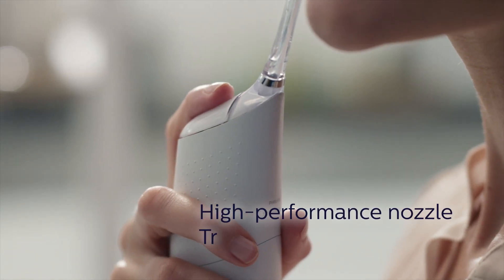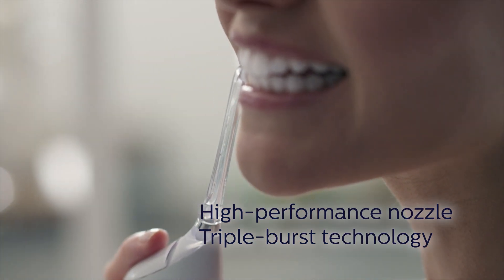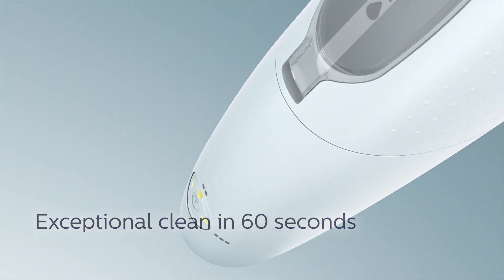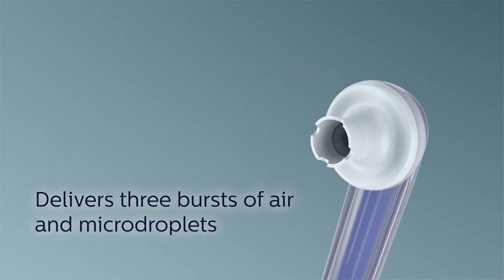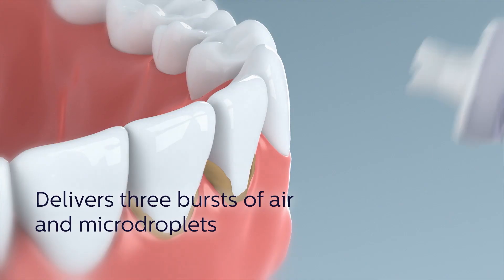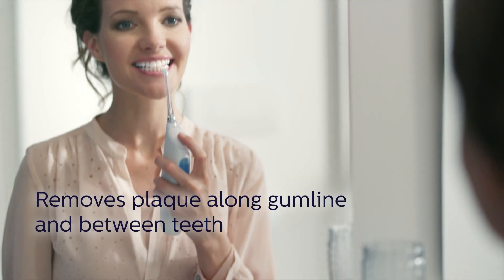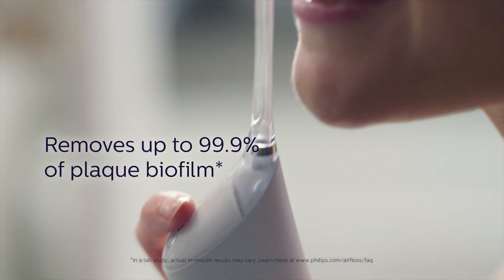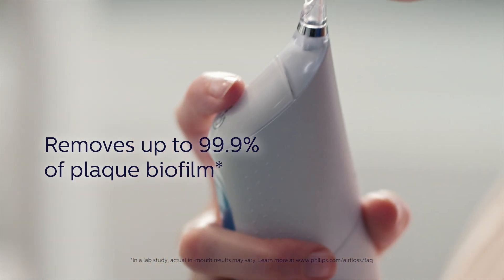Our new high-performance nozzle design and triple burst technology provide an exceptional clean in just 60 seconds a day. At the press of a button, Air Floss Pro delivers 3 bursts of air and liquid micro droplets to remove plaque along the gum line and between teeth. That's 3 times the cleaning action of the original Air Floss, for removal of up to 99.9% of plaque biofilm in the treated areas.